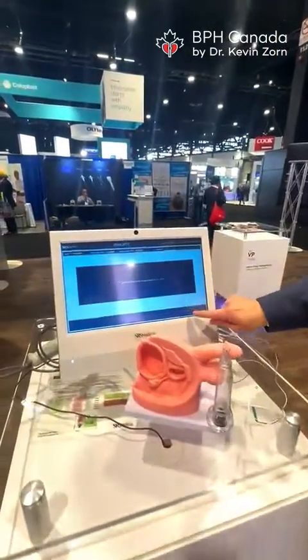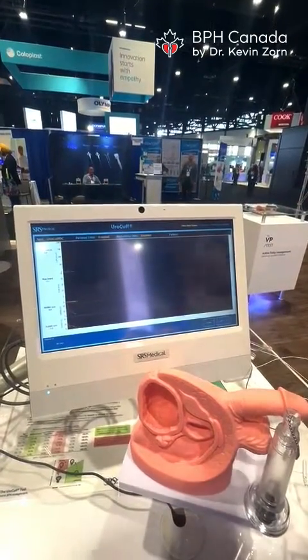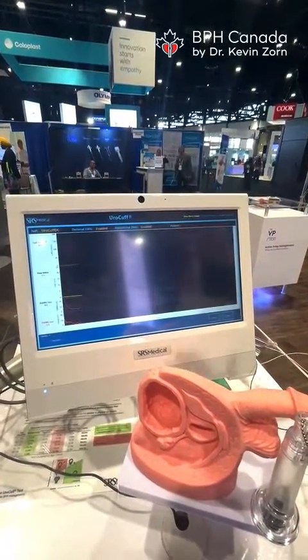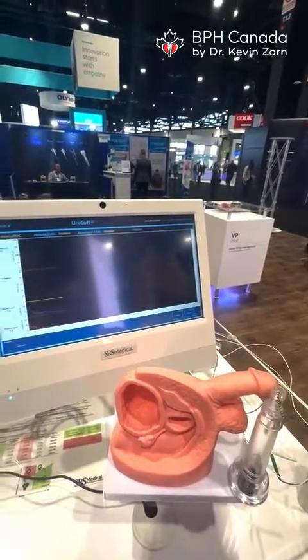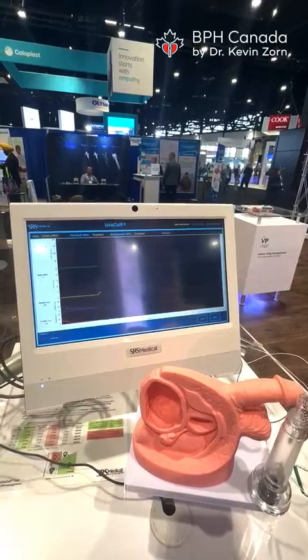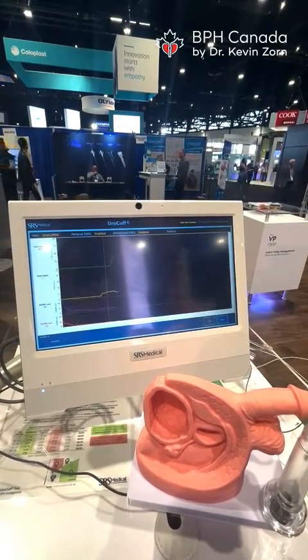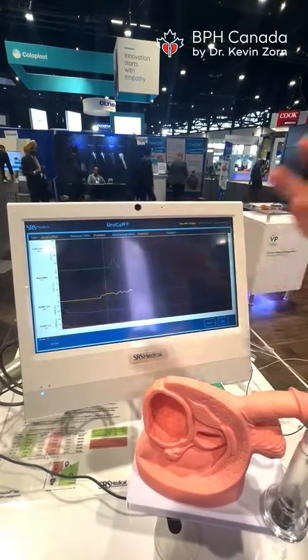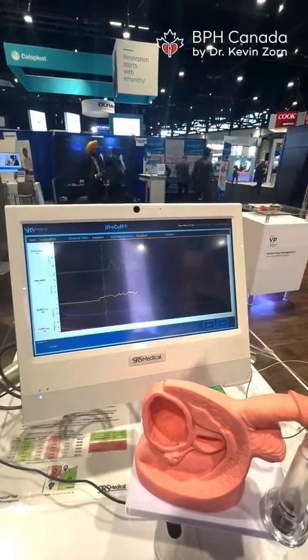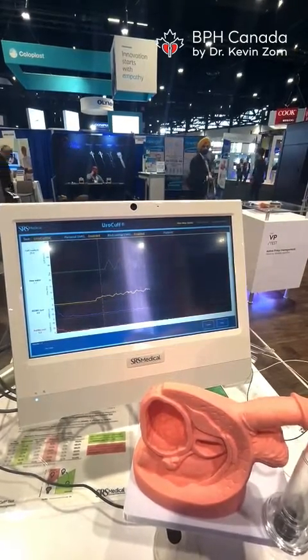So, start study. This would be a simulation, in real time, of a demonstration patient who will be brought to the bathroom. They'll place an external cuff on the tip of the penis that they'll urinate through. Here we see the initiation of the urination, and in real time, every 3 seconds, there are cycles, kind of like a blood pressure cuff, that apply some gentle pressure, not to the penis, but to the urinary flow just in front of the penis through the cylinder.